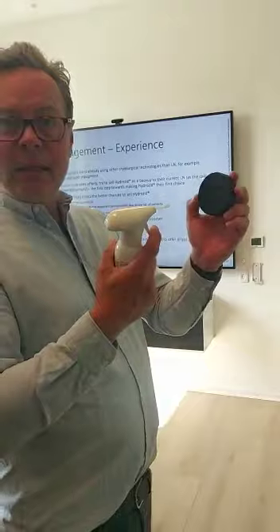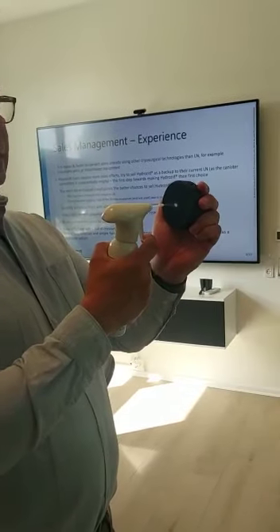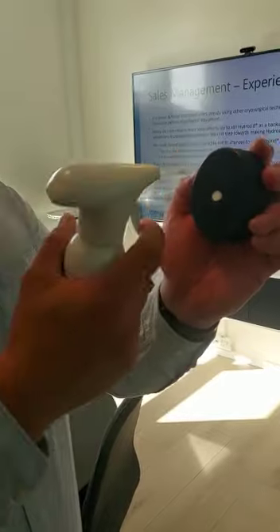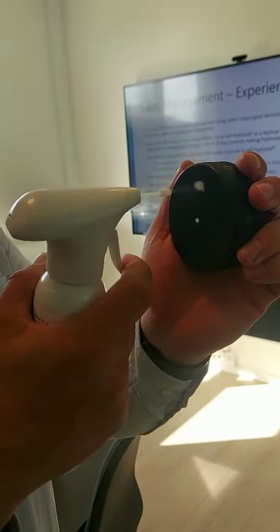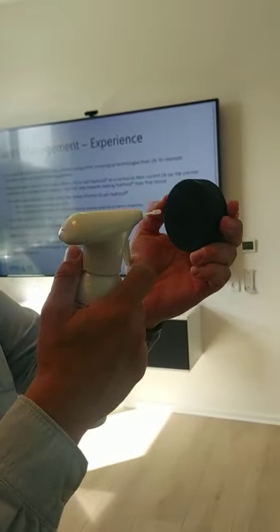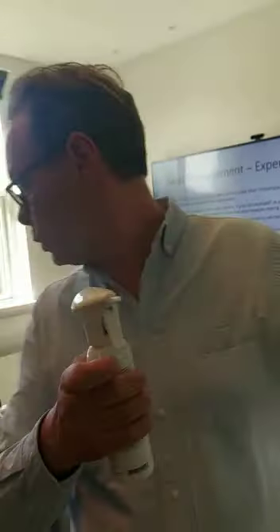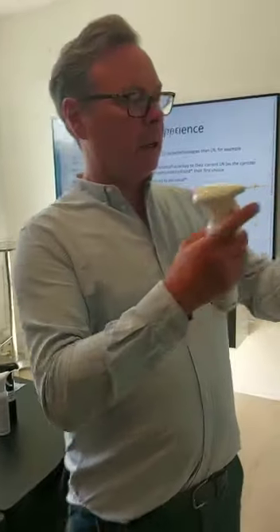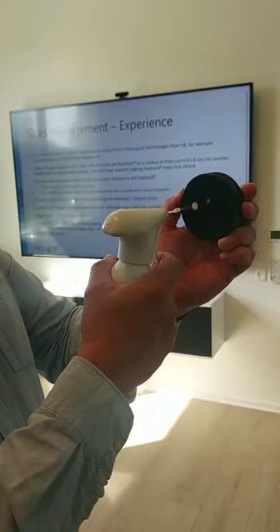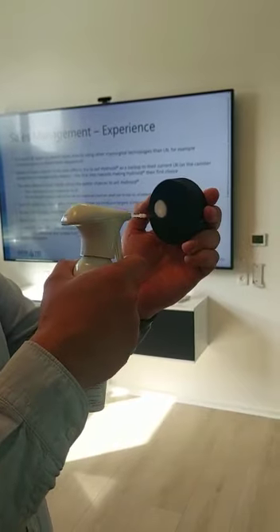The last thing is the sound when you treat. The sound should be just like a small whistling sound — you can almost not hear it. This is the right sound; it's supposed to sound like this when you treat. If you hear it louder, this is much too much. When you do it the proper way, you also have the opportunity to spread the spray up to a certain size — not bigger, I would say.